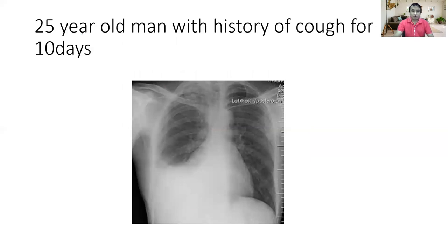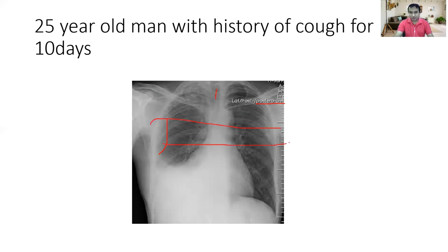Similarly, there is a 25-year-old man with a history of cough for 10 days. The clavicle is vertical and scapula is outside, so this is probably the PA view. The upper and middle zones seem normal. But in the right lower zone, there is homogeneous opacity with blunting of the costophrenic angle — we do not see the costophrenic angle here. So this is the chest X-ray of pleural effusion.